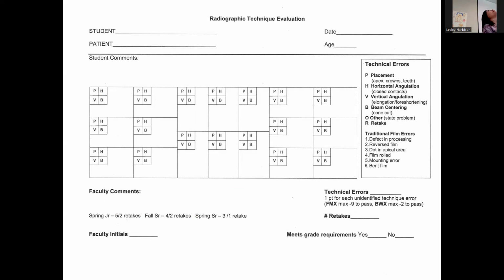I'm not comfortable. If you don't mind going over again, which ones are the ones you put direction? Yes. So of the four, the horizontal, angulation, and vertical are just an X. You just mark it, it's there or not there. Placement, you're going to do your X, and then you'll shade the direction that you want to move your sensor.